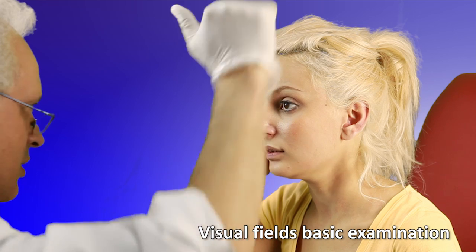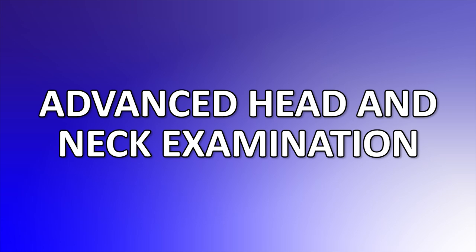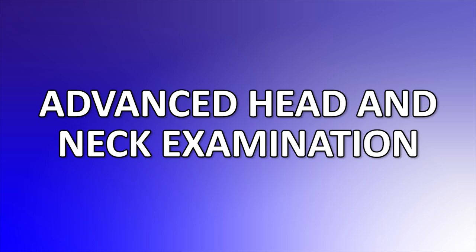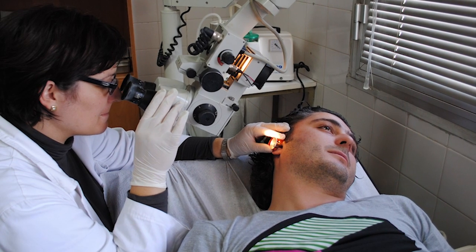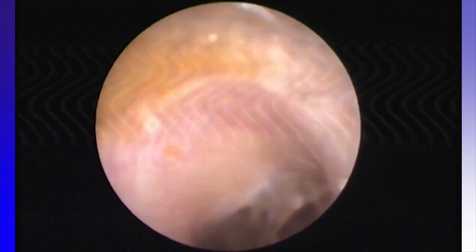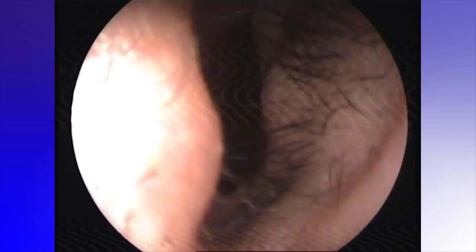Advanced examination, which should be performed by the otorhinolaryngologist and the very well-trained general practitioner: otomicroscopy and endoscopy of the ears, flexible and rigid endoscopy of the nose and nasopharynx.